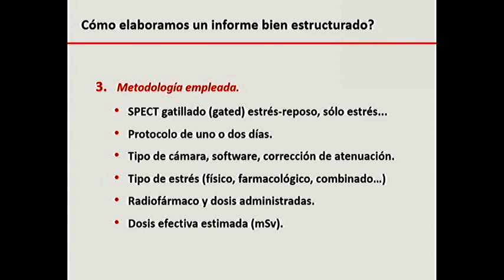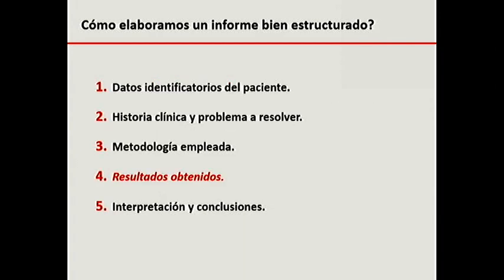we see the need of including information about the effective dose so that the patient can have a dose history of him or herself. For example, yesterday we took a tomography, today we had a nuclear imaging, tomorrow he will have a thoracic image, and the day after that he'll have another process. So all of this has to be included in the report. In a specific institution, for example, they could be implementing the dosing history of the patient to see the effective doses of the patient and of the studies that compromise the radiation.